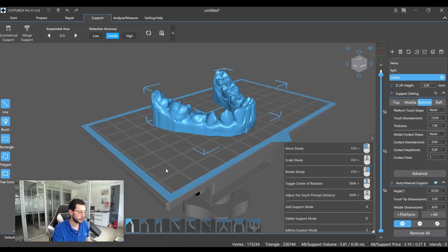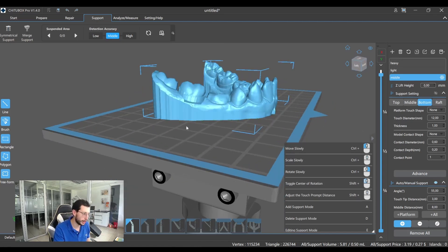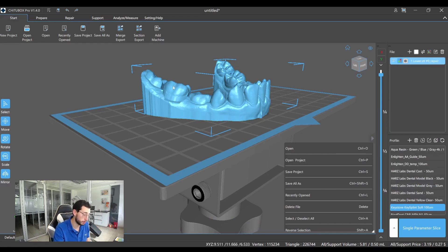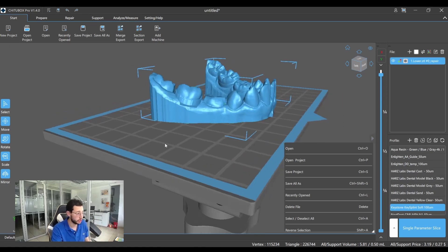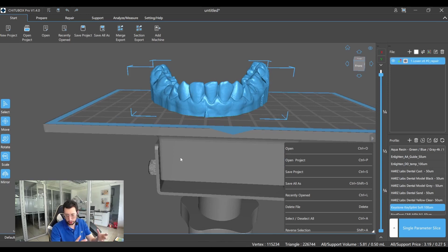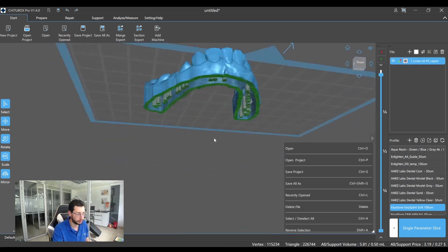Finally, although this is almost perfect, we have a problem here because since this is a closed space, it will create a suction effect when every layer is added. This suction effect can deform the model or unstick it from the platform. So to avoid this problem, the last step is to add some drain holes around the model that will reduce that suction effect and also prevent resin from getting stuck inside the model.